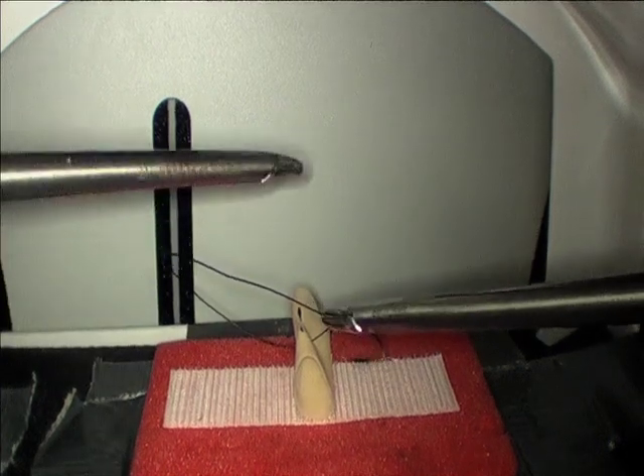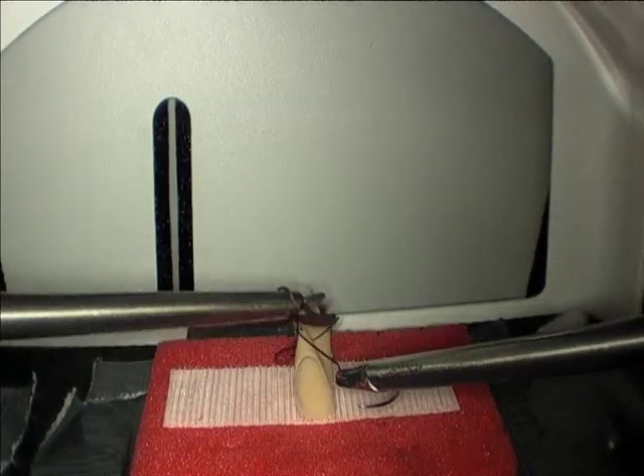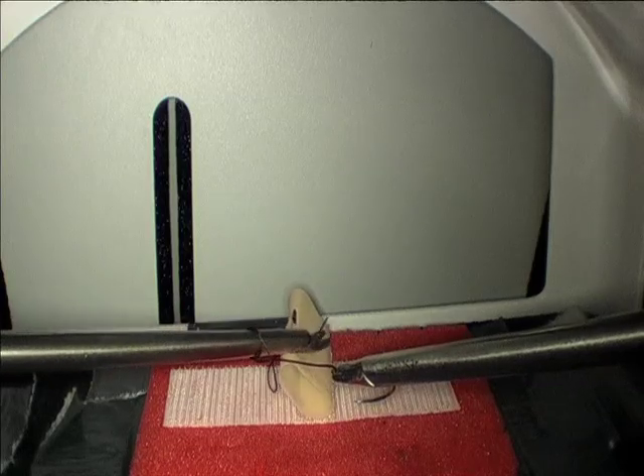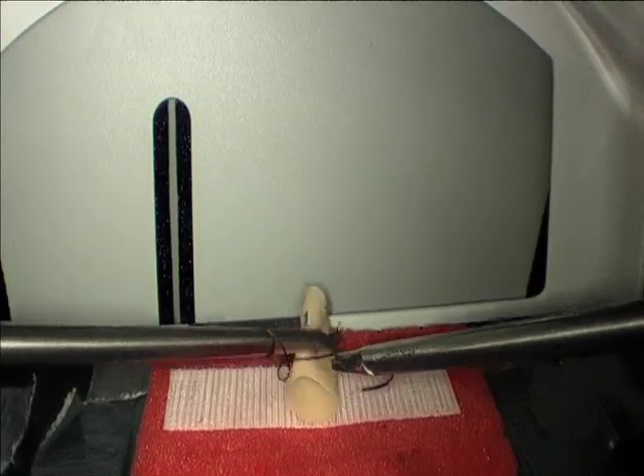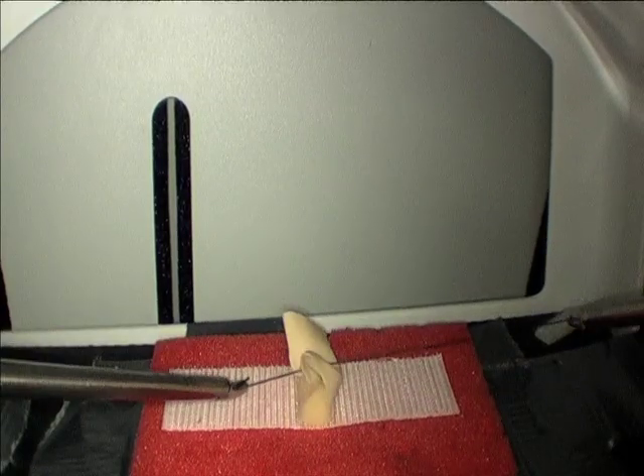Bring your left hand over the needle driver twice, grasp the suture, and pull it through. Remember to leave a short tail, or it will make your next throws more difficult.